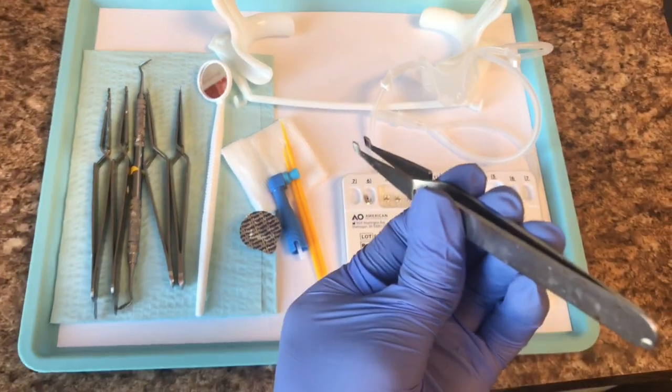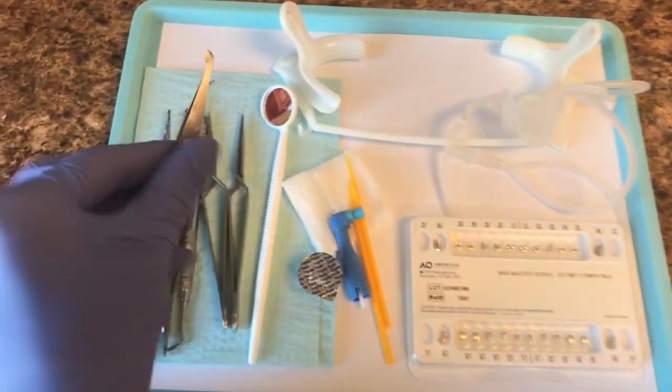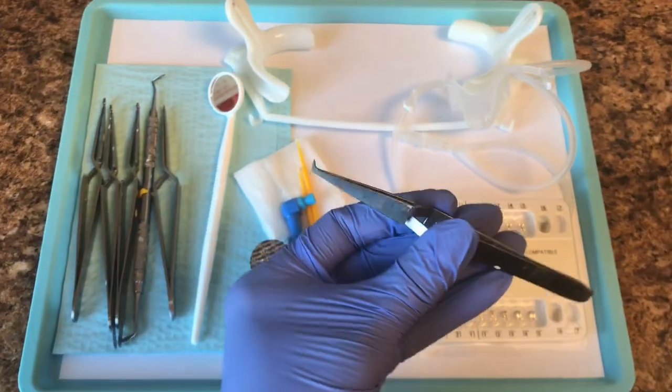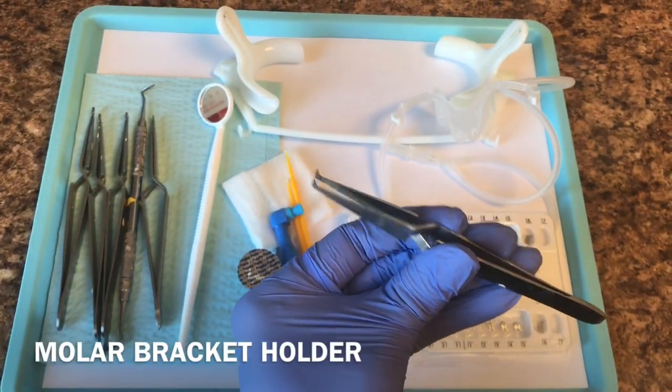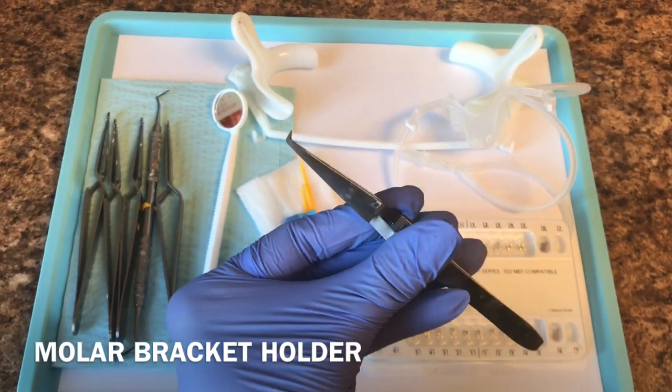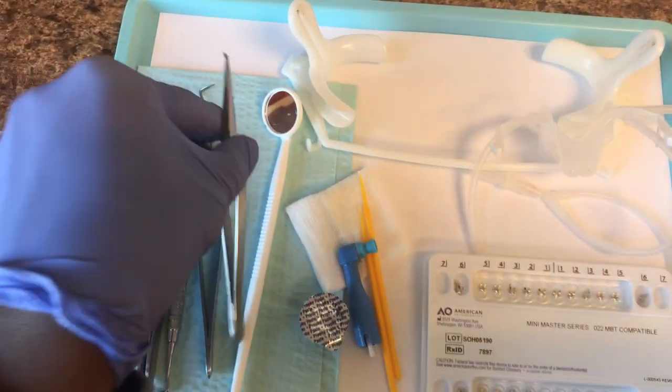It'll basically hold the bracket in place. We also have bracket holders for the molar brackets, which are the brackets that go on the molar teeth. They are shaped a little differently, but they do open and close just like the original bracket holder. And those are your molar bracket holders.